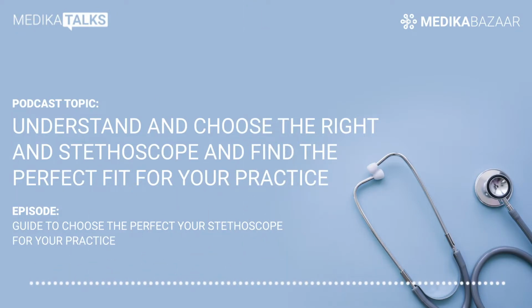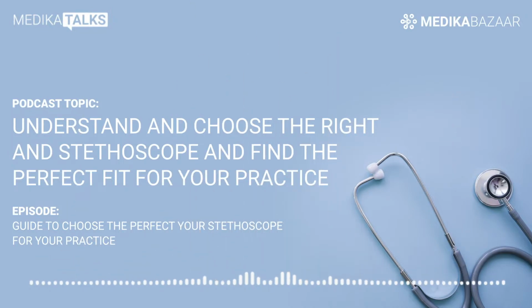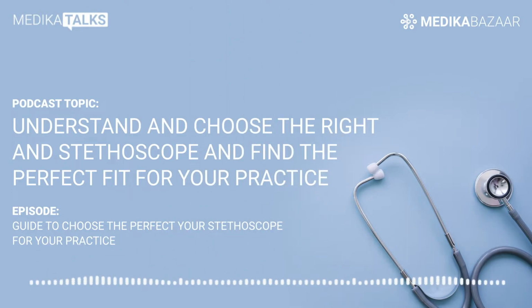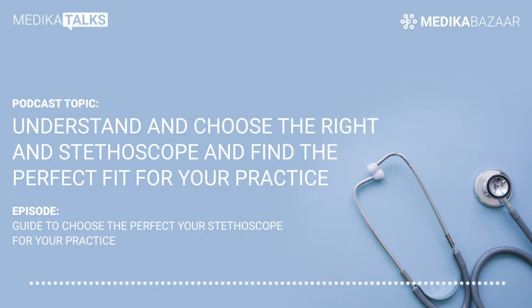Recording stethoscope. Some stethoscopes use a direct audio output that can be used with an external recording device such as a laptop. By doing this, the healthcare professional can compare the current recording with the previously recorded signal and improve diagnostic capabilities. The previously recorded sounds can be heard later through the headphones or stethoscopes.